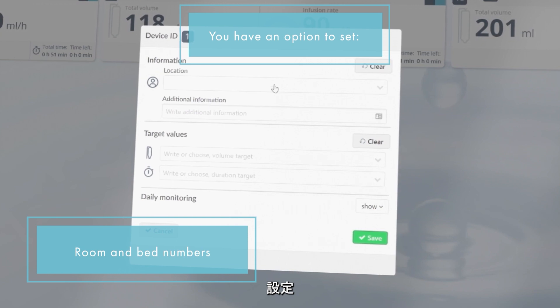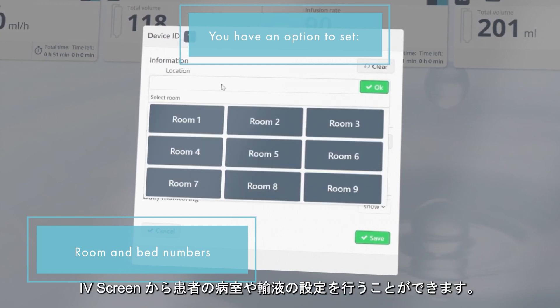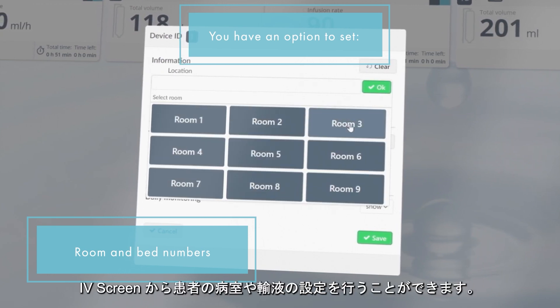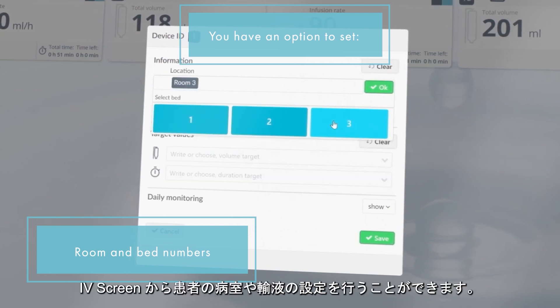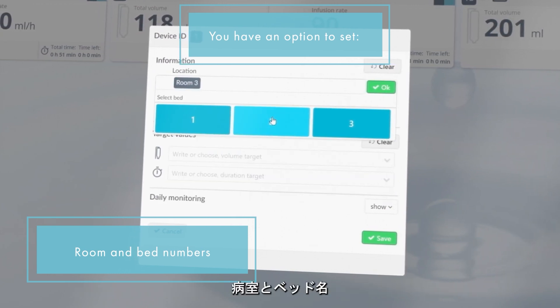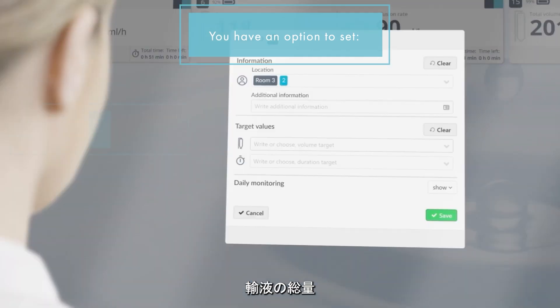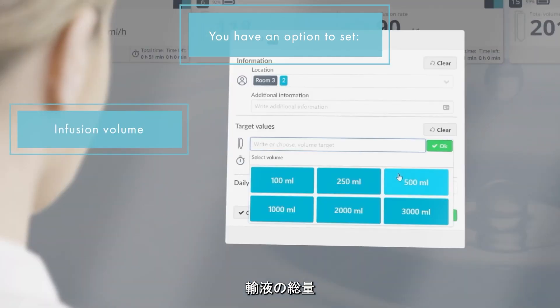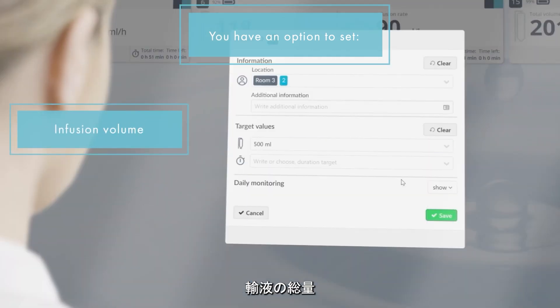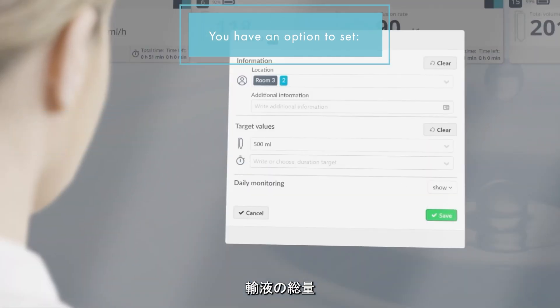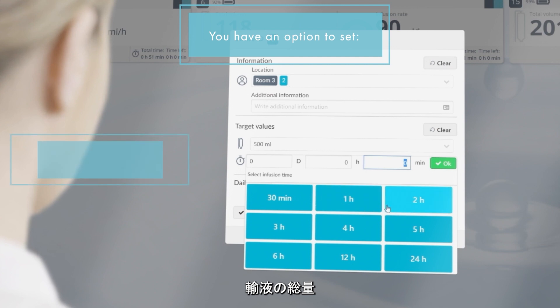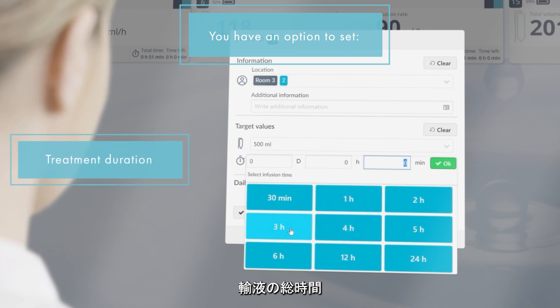On the IV screen, each device can be assigned to a room location and to a patient's bed number. There is an option to set the target values for the fluid volume to be infused and the treatment duration.